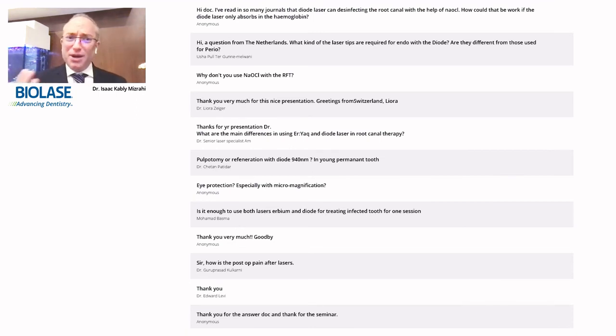So my belief is that in those reports on the combination of sodium hypochlorite and diode laser, the diode laser will not do anything to the sodium hypochlorite because it's not absorbed there, as you state in your question. The disinfection process is being made by the diode laser, especially because of the wavelength of 940 nanometers.